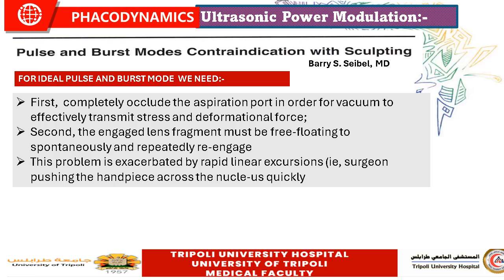And both these two factors are not present during sculpting, since the phaco needle is moving against a static and stationary lens nucleus, the inertia of the lens nucleus, so there is no complete occlusion of the phaco tip. Another thing, the lens is fixed and is not freely mobile.